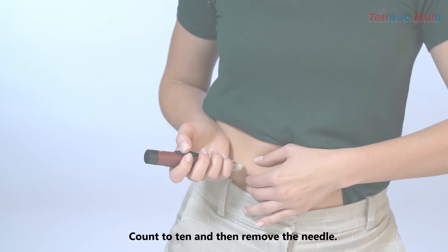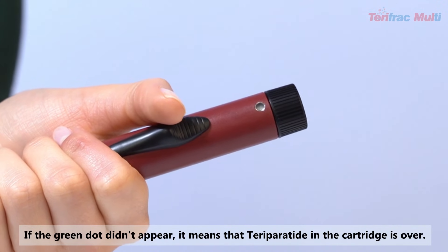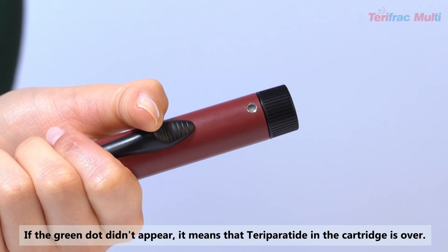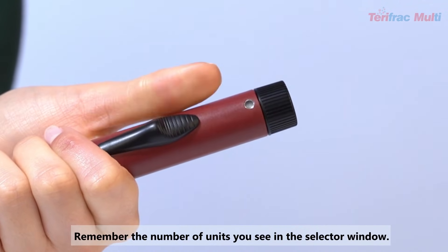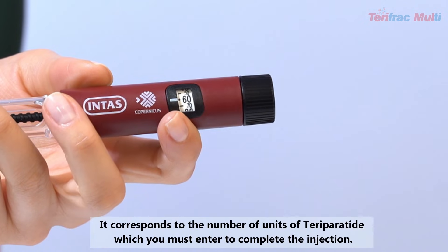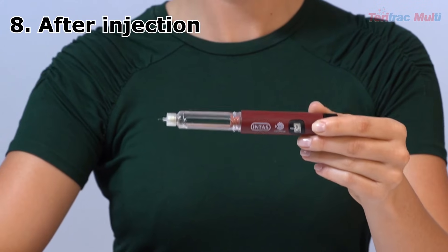Hold the trigger until a green dot appears in the window, signalizing the end of the injection. Count to 10 and then remove the needle. If the green dot did not appear, it means the Teriparatide in the cartridge is over. Remember the number of units shown in the dose selector window — it corresponds to the number of units you must enter to complete the injection using a new cartridge.